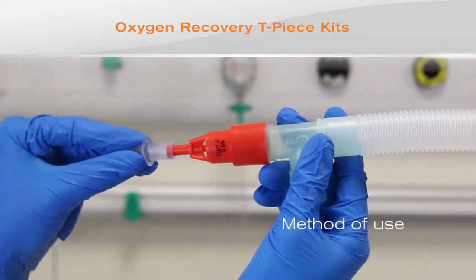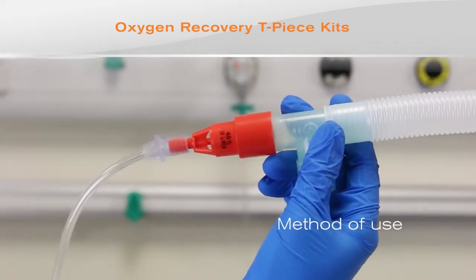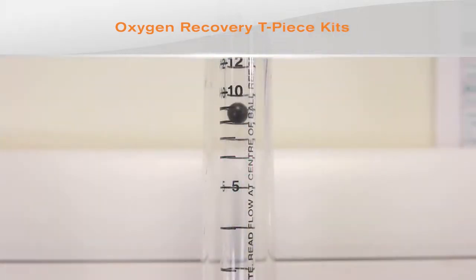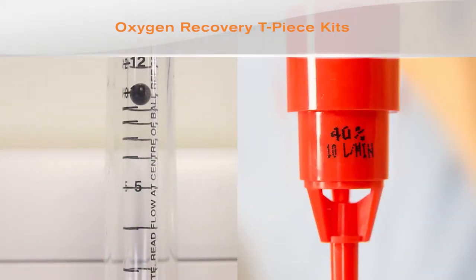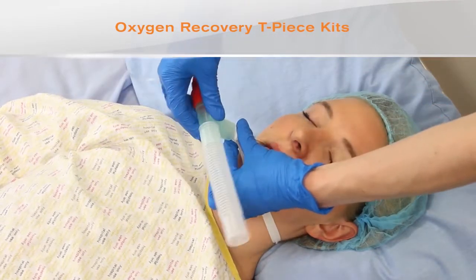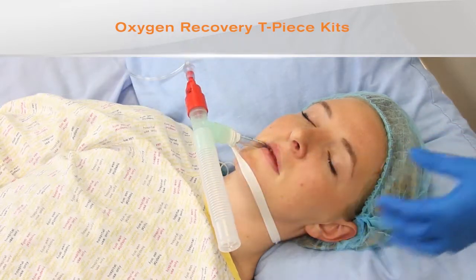Attach one end of the oxygen tubing to the valve spigot and the other end to the oxygen flow meter, and set the flow meter to the flow indicated on the valve. Connect the T-piece to the 15mm connector of the tracheal tube or supraglottic airway device.